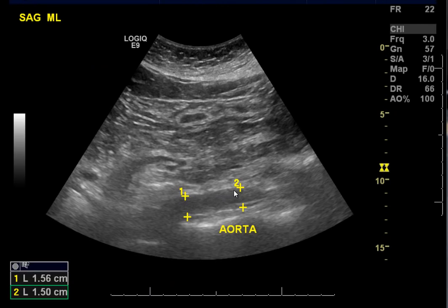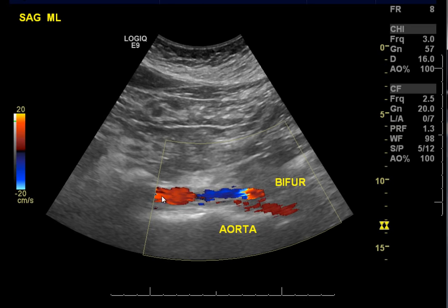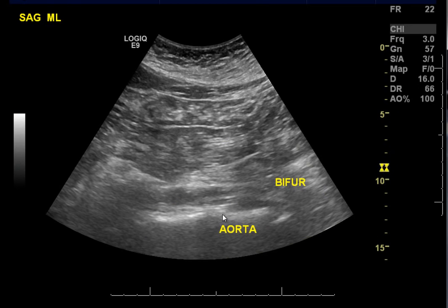Here we see the abdominal aorta. And unfortunately, bowel gas and depth of the aorta sometimes precludes its display. But here we see the mid-aorta, and the walls of the aorta having muscular layers and sometimes atheromatous disease. You're going to see them very well compared to the cava, where the walls are more delicate. So here they've put the color on, and you can see the aorta is deep. It's about 12 centimeters from the anterior abdominal wall.